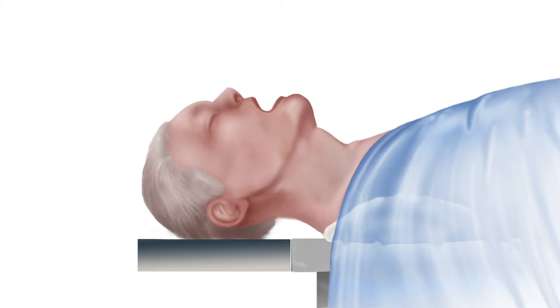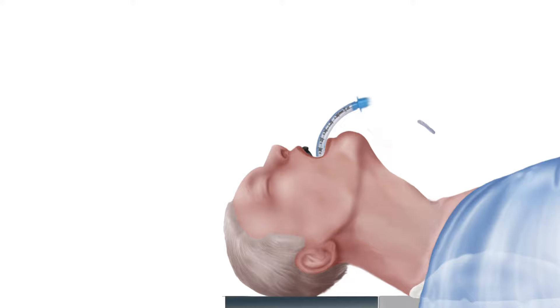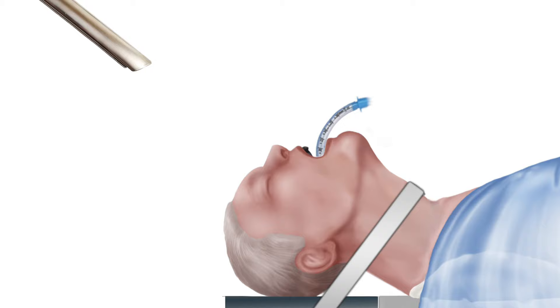In order to safely and precisely remove the vocal cord mass to ultimately achieve a normal voice without any raspiness, this excisional procedure is performed under general anesthesia. After intubation, a mouth guard is placed to protect the upper teeth from chipping or cracking. The head is placed into a hyperextended position. Tape is used to apply consistent pressure against the cricoid cartilage to allow a straight shot view of the mass from the mouth after instrument placement.